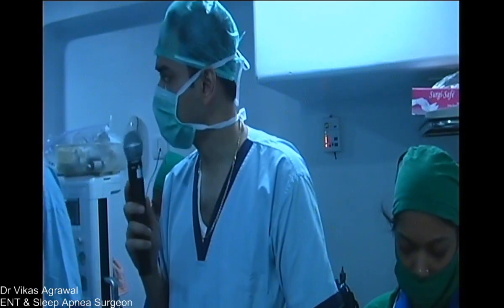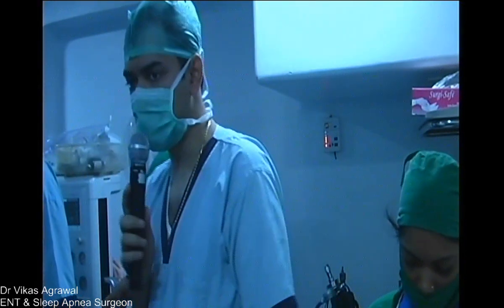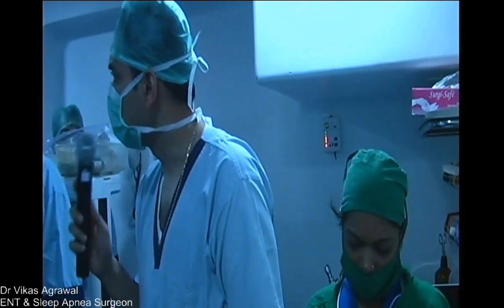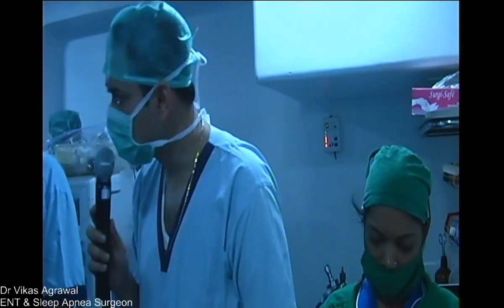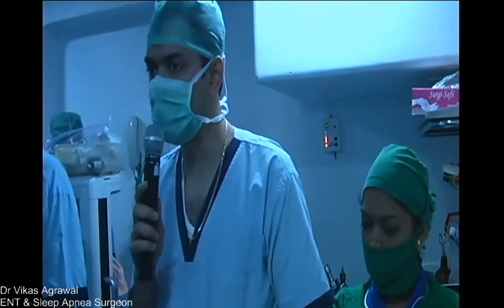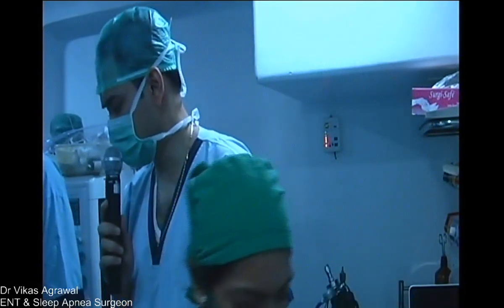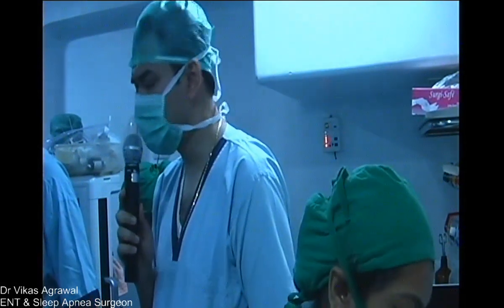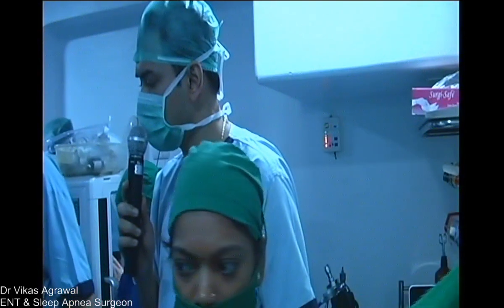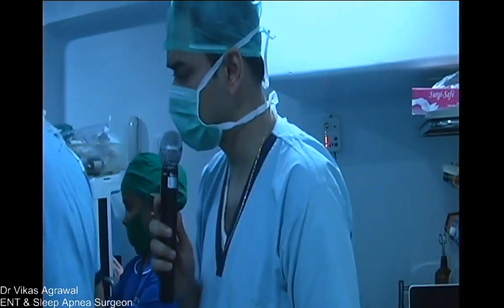So Dr. Kalpesh, would you like to... Yes, there is a question which is a repeat question, the cost of the BIS monitor. The BIS monitor, the one that we have here, is I think a Covidien. It's about 2.5 lakhs and there is a disposable usage of about 1,000 rupees per patient. It's a good tool, but absence of this tool should not stop us from doing DISE or sleep apnea surgery.